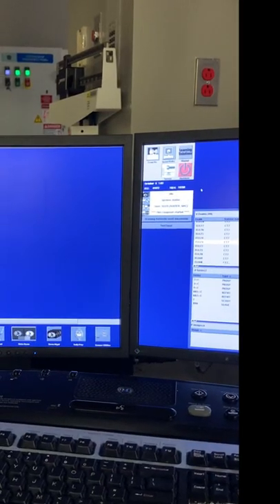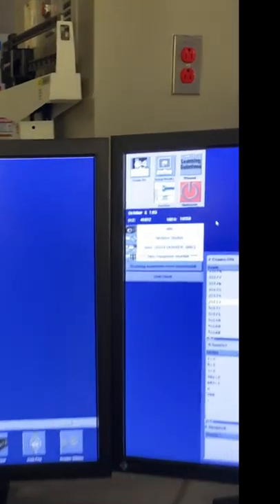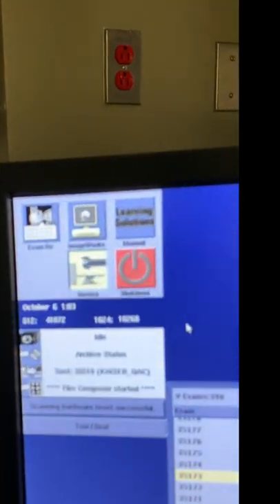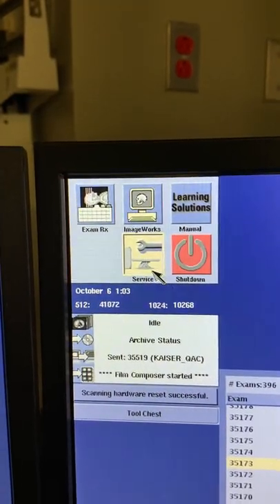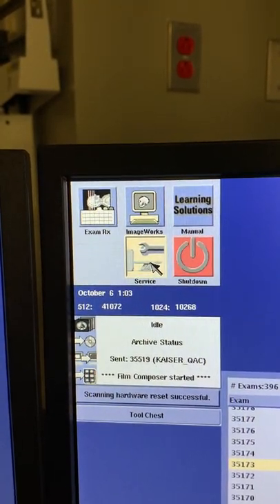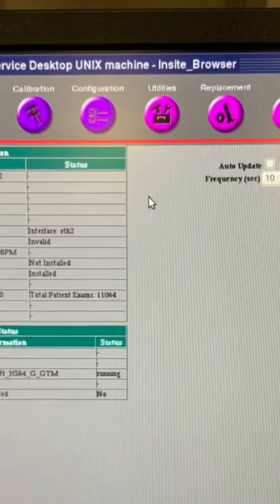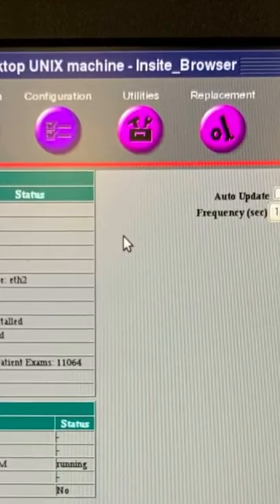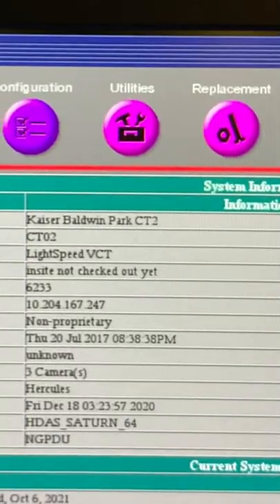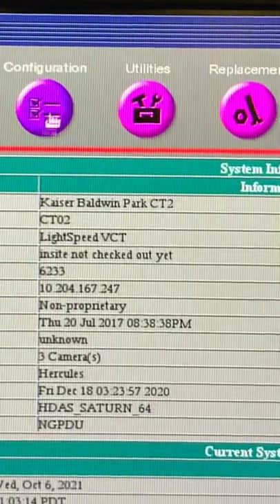Once your USB has been inserted into the SCSI Tower, click on the service icon that is located on the upper left corner of the CT system right side monitor. Your service browser will populate at this point.